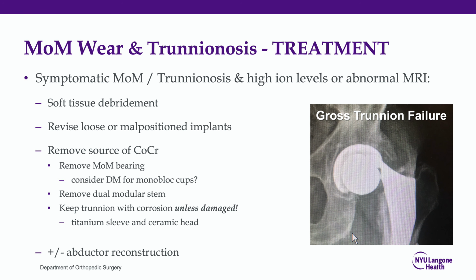The decision to do that is going to be, first off, you have to acknowledge to yourself and to your patient that it's off-label. And then second, you have to think about what is the coverage angle of that particular component. What is the component position? But the reports actually show similar and in some cases superior outcomes with that reconstruction compared to removing a well-fixed shell on the acetabular side, so that's a consideration.